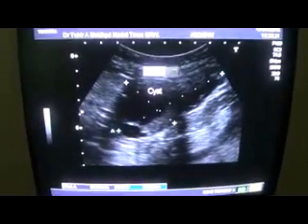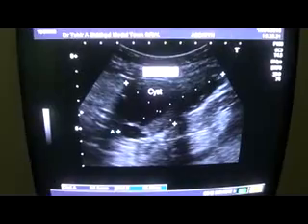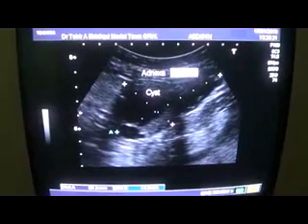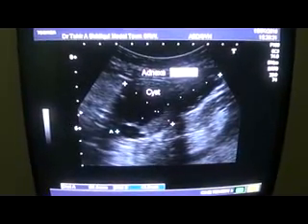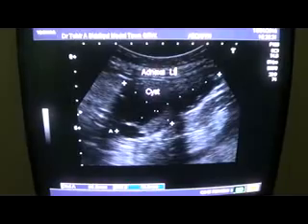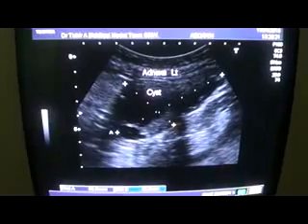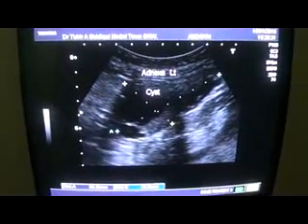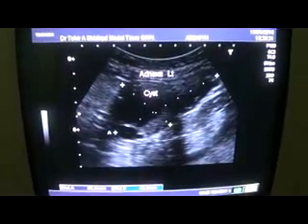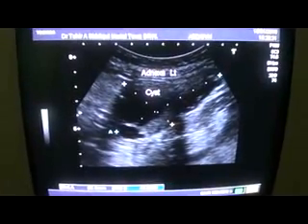And then we saw bilateral pleural effusion, and there is dilation of the hepatic veins. We saw that, and this pathology in the pelvis appears to be of aggressive nature, and the other pathology, that is the bilateral pleural effusion and dilated hepatic veins, is due to cardiac pathology that should be ruled out. Thank you very much.